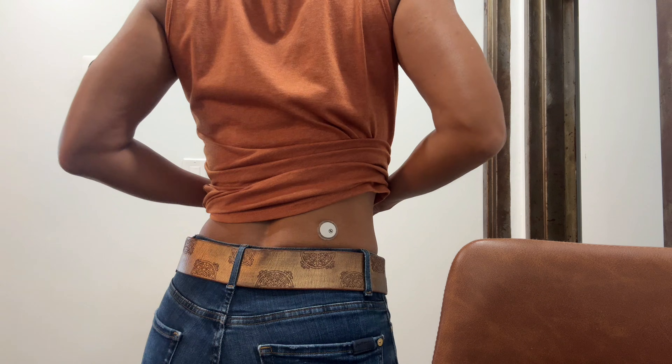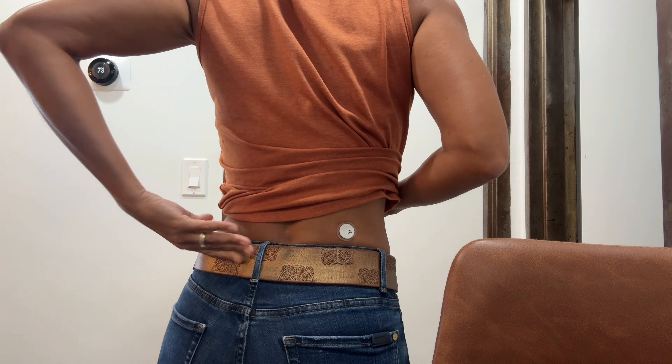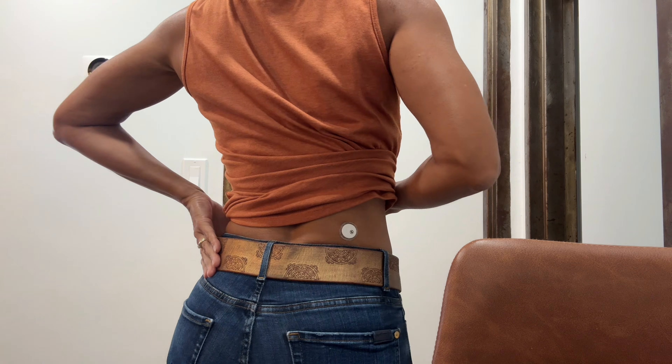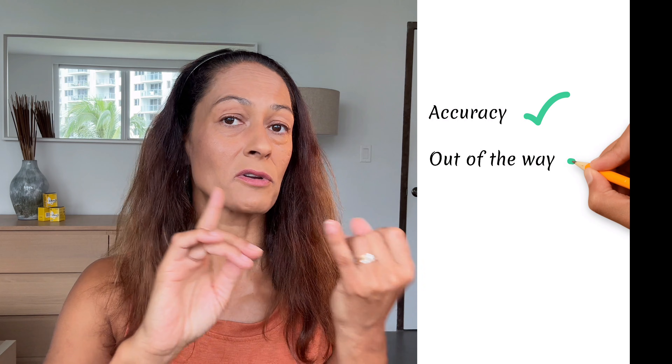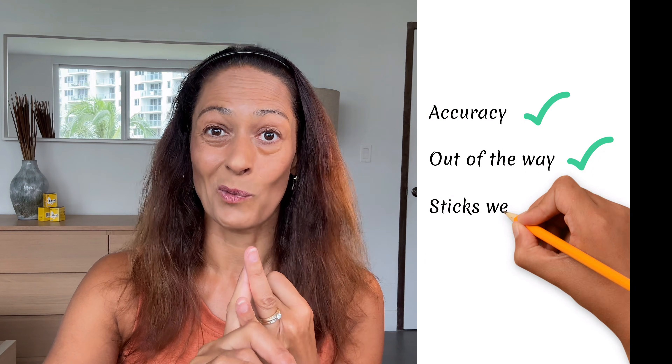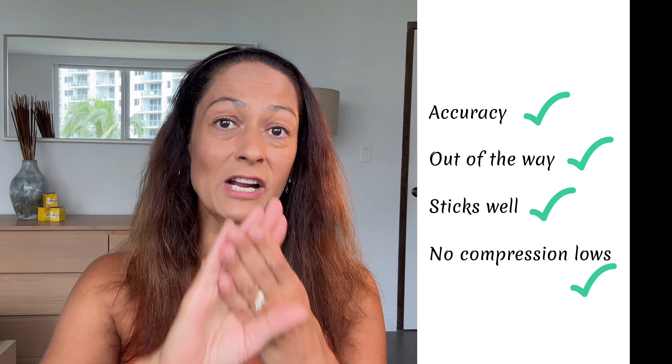If you're not quite flexible enough to twist around and look at your lower back, you can use a mirror. It's fairly easy to insert a Libre sensor since you can do it with one hand and it does not require an overlay tape. The only thing you have to think about is that if you wear jeans and a belt, you don't want to place it so it sits directly underneath the belt. When I've worn my Libre on my lower back I've seen extremely good accuracy, it's out of the way, it sticks really well, and I haven't had a single compression low.